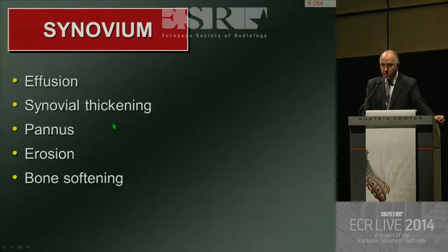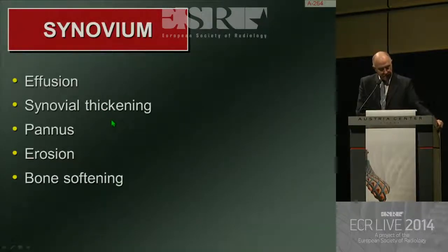The basic radiology of synovitis is fluid formation in the joint. By this, we're talking about an effusion and synovial thickening. That synovial thickening, clearly you are not going to see on a plain film, but if you do an ultrasound scan, you are going to be able to differentiate the solid fronds of synovium from the fluid. And if you do an MR, particularly with contrast enhancement, you'll also see, obviously, the pathology, which is synovial thickening differentiated from the effusion.